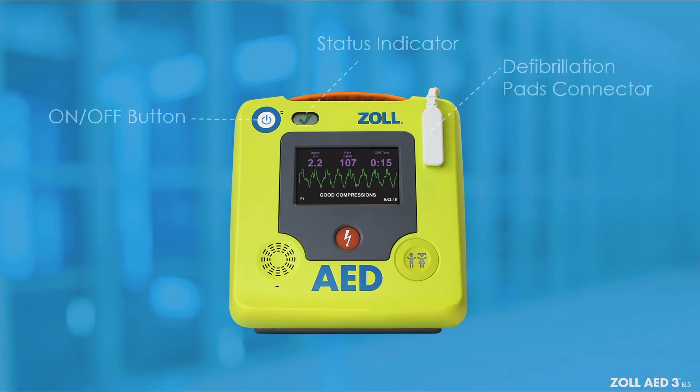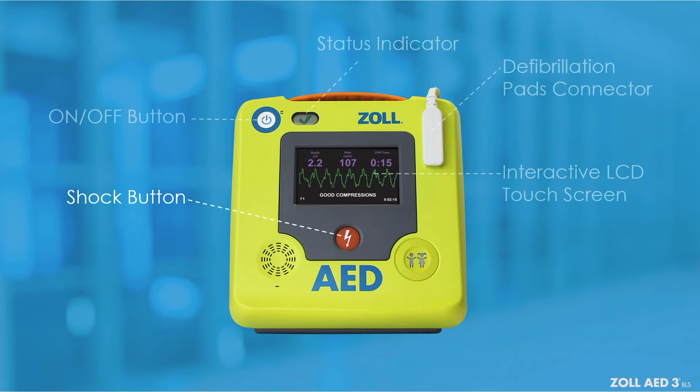The interactive LCD touch screen displays graphics and a CPR dashboard to guide the rescuer. The shock button illuminates when the AED is charged and ready to deliver a shock to the patient.